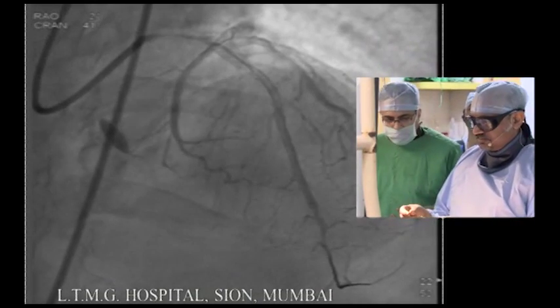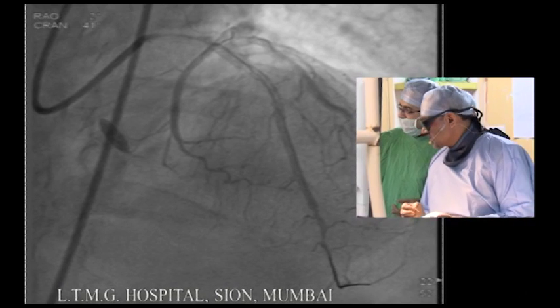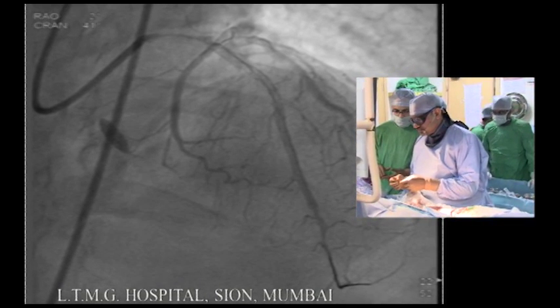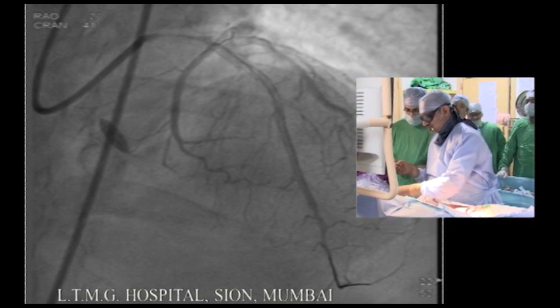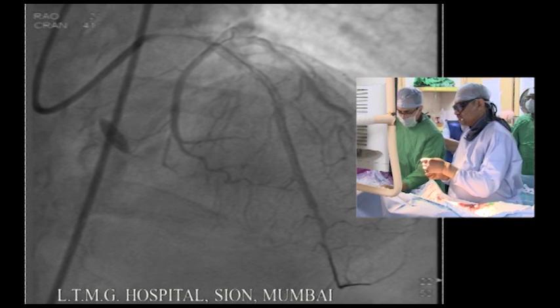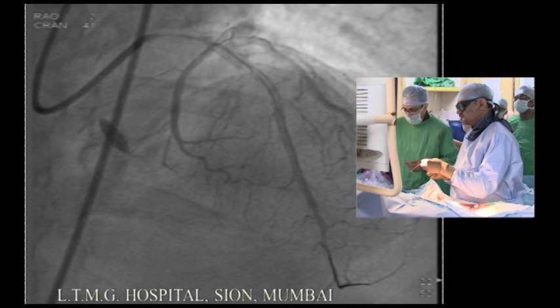So by a vote of hands, how many would have done an IVUS or an OCT before, let's say before putting the balloon and then after putting the balloon? So before putting the balloon, would anyone start with an IVUS? Without the first balloon in place, just an IVUS.